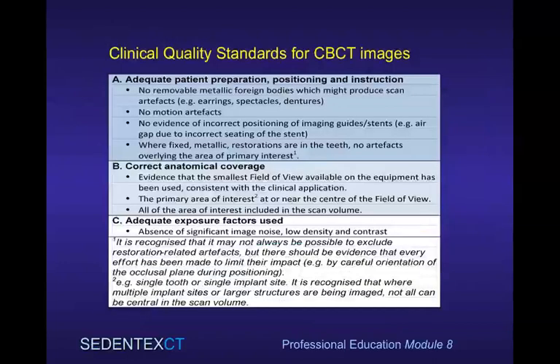Here are some more detailed clinical quality standards for cone beam CT images, as taken from the Sedentex CT guidelines of 2011. This is helpful in performing a clinical audit as it gives us some reference information against which we can compare our own images.